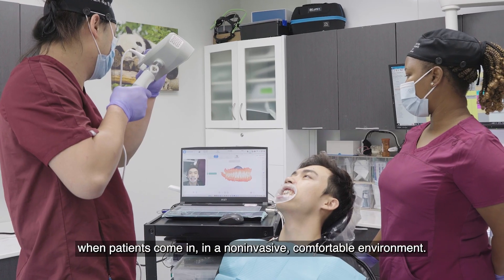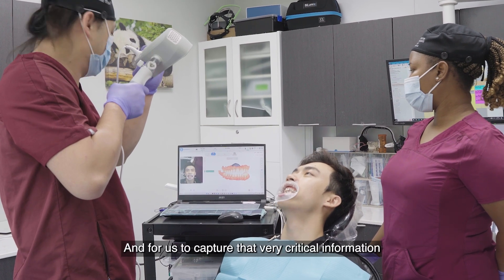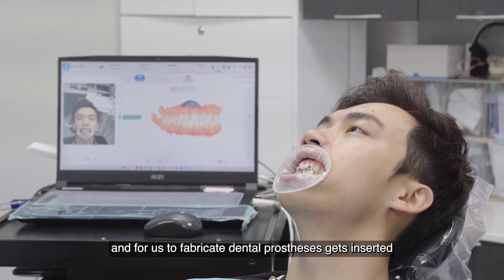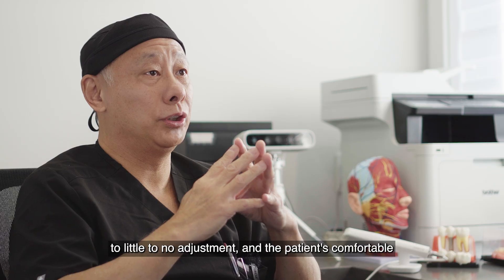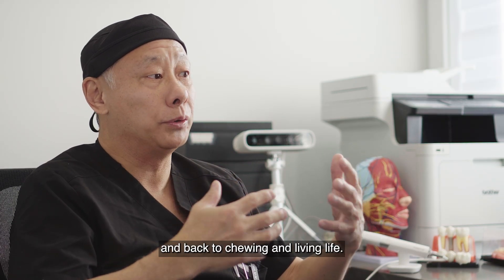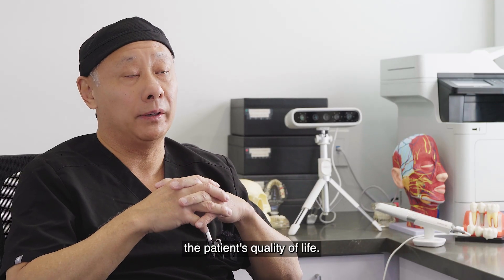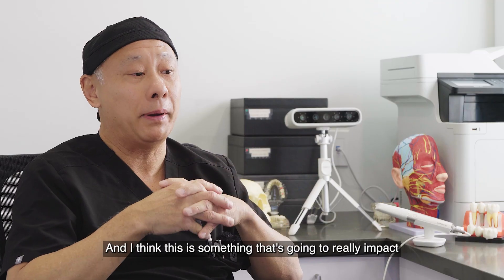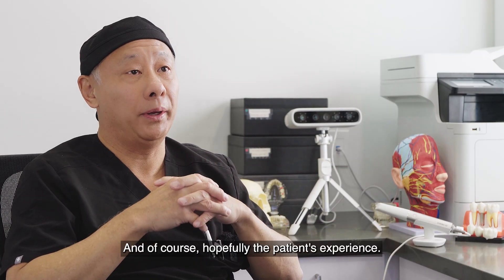When patients come in, in a non-invasive, comfortable environment, we capture that very critical information, fabricate dental prostheses, insert them with little to no adjustments, and the patient is comfortable and back to chewing and living life. Our ultimate goal is to improve the patient's quality of life, and I think this is something that's really going to impact our clinical dentistry and hopefully the patient's experience.